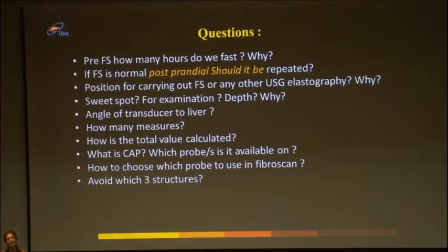It's very easy. Very good. Again, radiology residents. I don't see anybody else answering. How many measures do you take when you take a Fibroscan measurement? We've all had it for executive health checkups or otherwise. How many measures do you need? Very good. Anybody else will answer from that side?